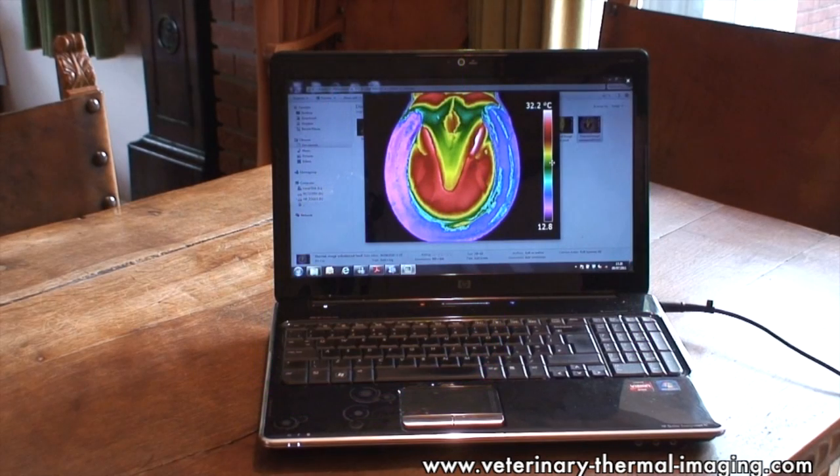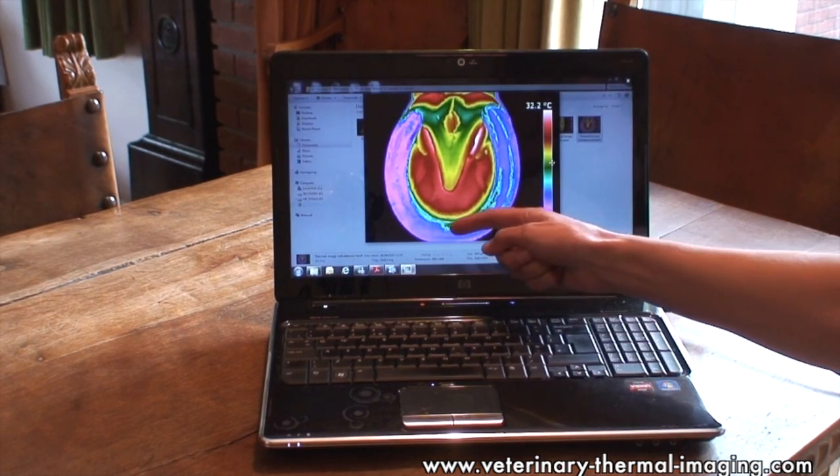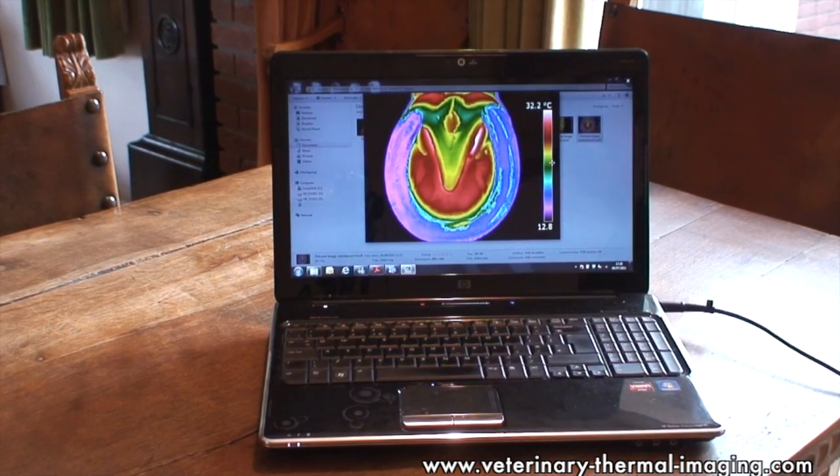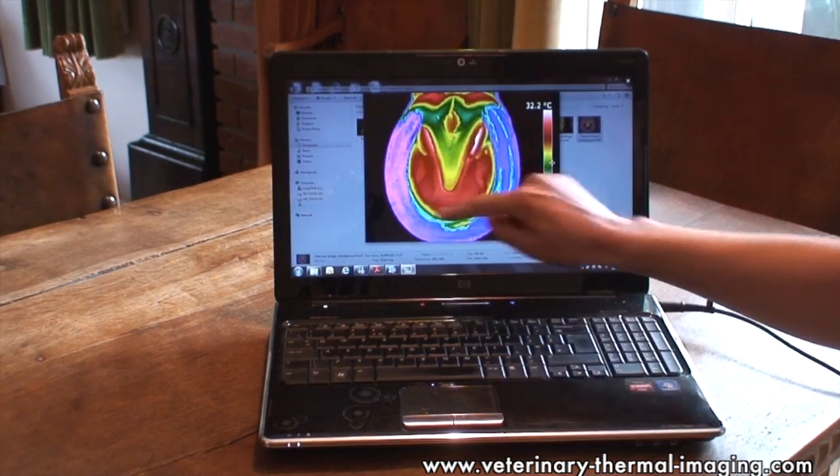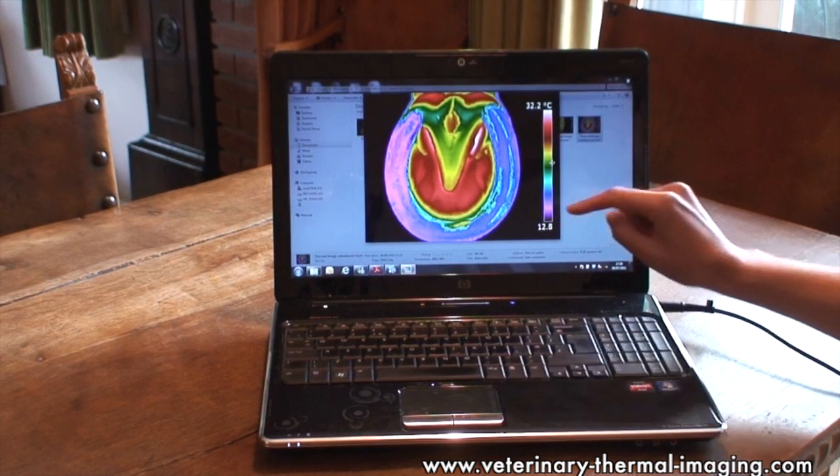When we image the underneath of the foot — looking at the sole — we can also pick up areas of imbalance. You can see in this hoof it's slightly warmer towards the inside, moving through these blue colours, than it is towards the outside through these purple colours. So we can see that this horse is placing more weight through the inside of his foot.